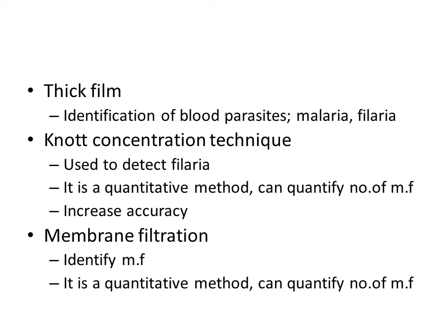And membrane filtration, this is very cost effective because the membrane and the filtration instruments are very cost effective. So this is also used to identify the microfilaria. It's also a quantitative method, we can quantify the number of microfilaria.